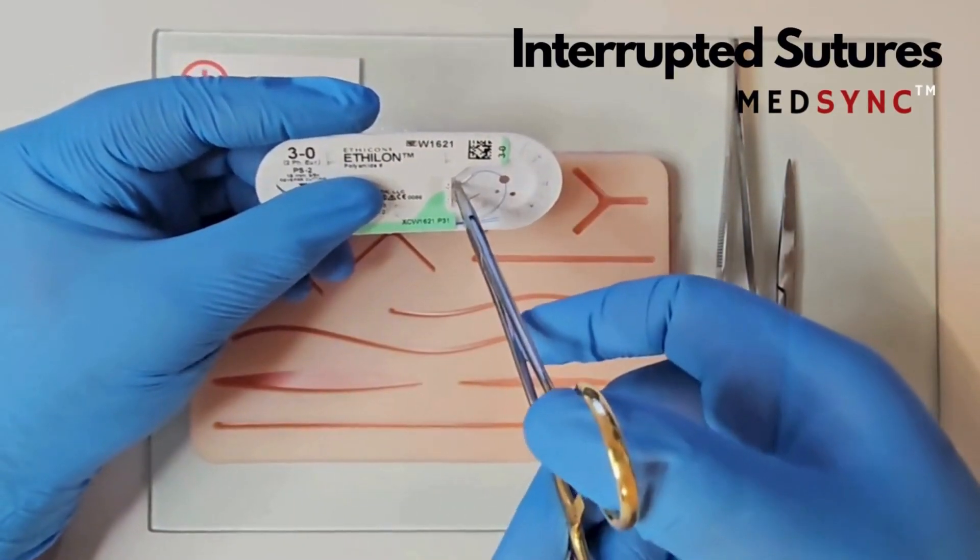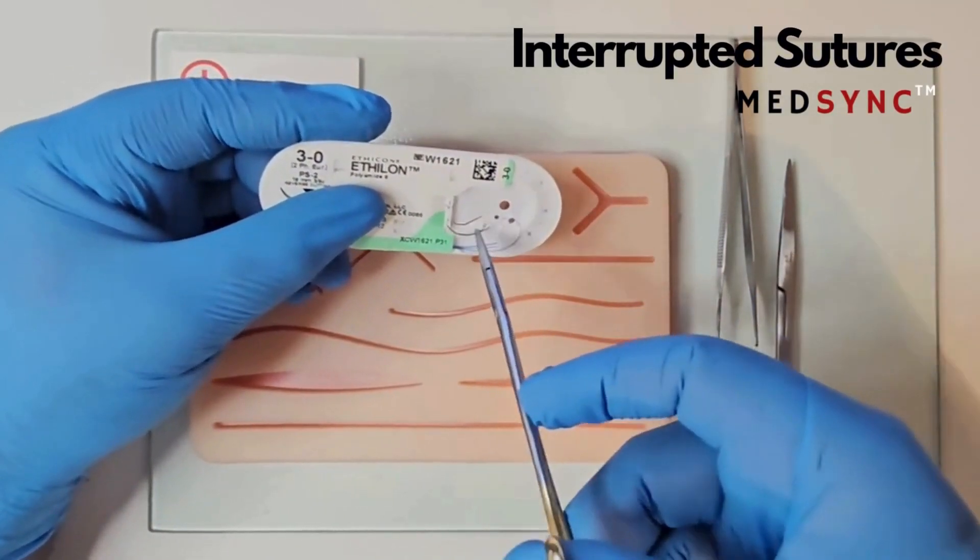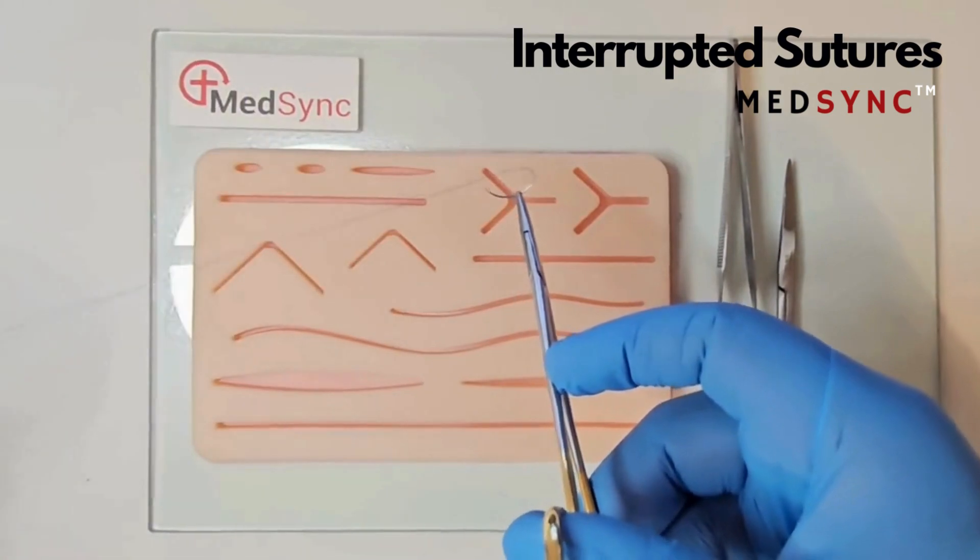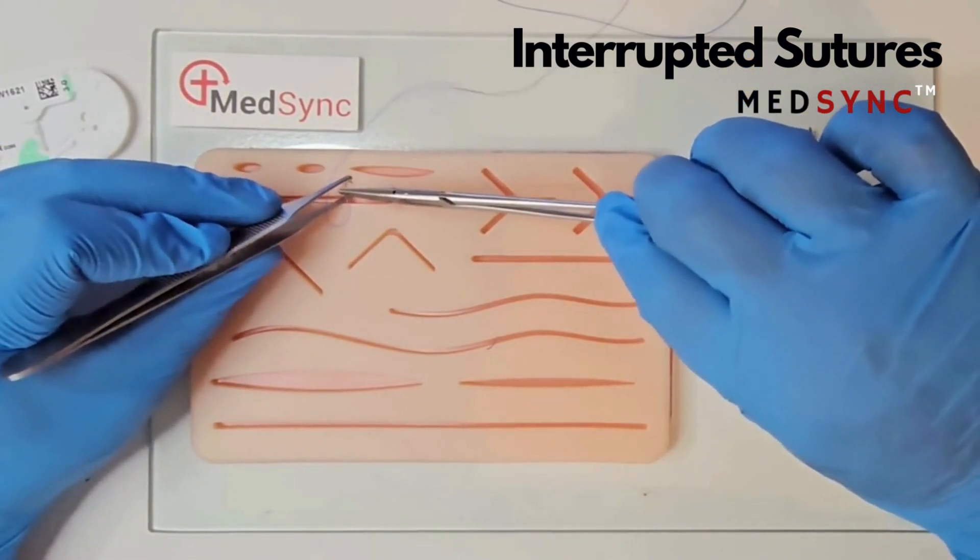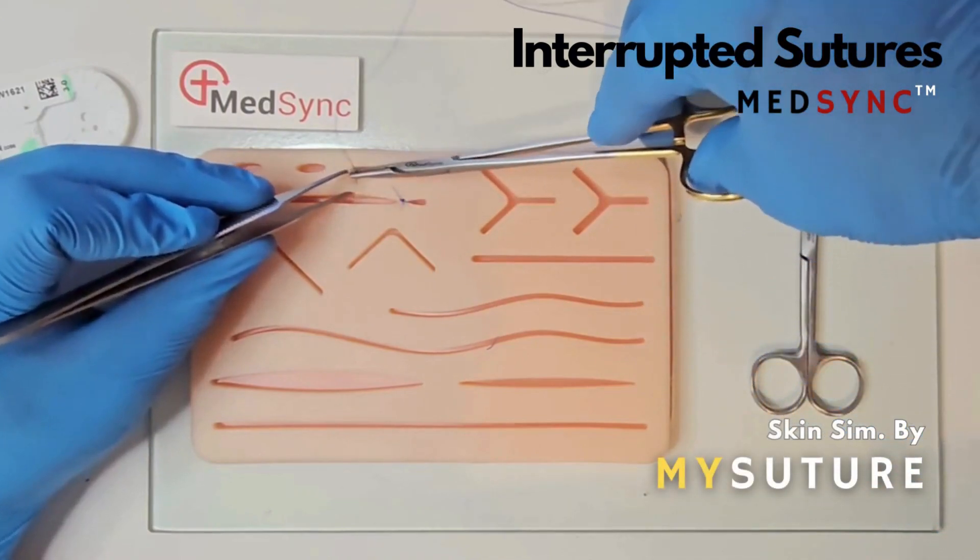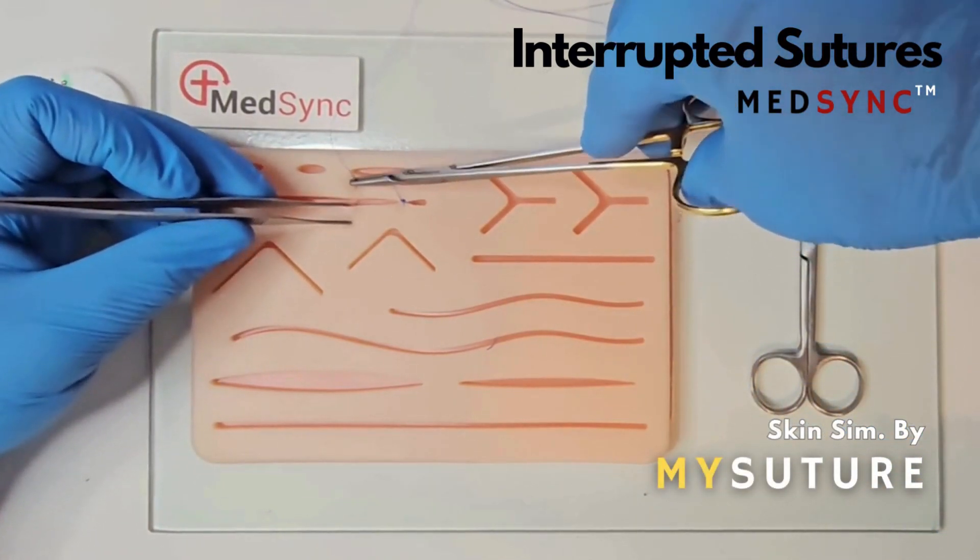Mount the needle in the packet two-thirds along the body. Keep the needle within the surgical field and pull the packet away. Enter the skin at 90 degrees. The hand rotates from prone to supine.